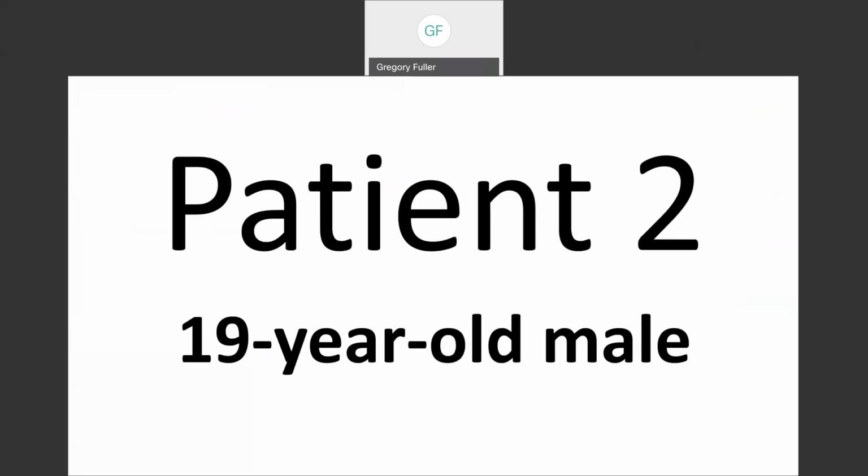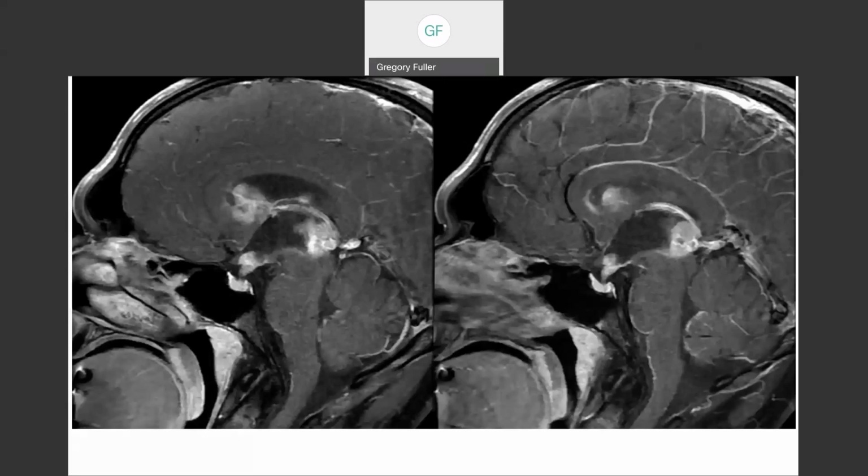The next thing we get is imaging, the pre-op imaging, which is crucial to the surgical pathologist. This may totally take germinoma off the map. I mean, if I'm going to show you a spinal cord lesion, it's basically gone. All right, let's see. Everybody ready? Here's the imaging. What do you think? It's a little more complex.